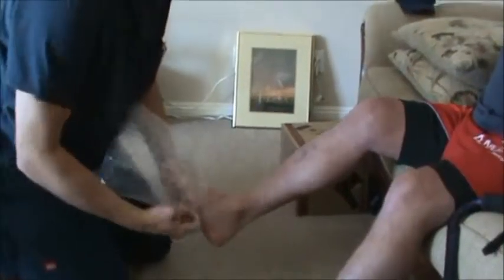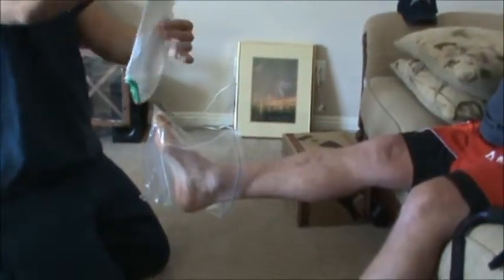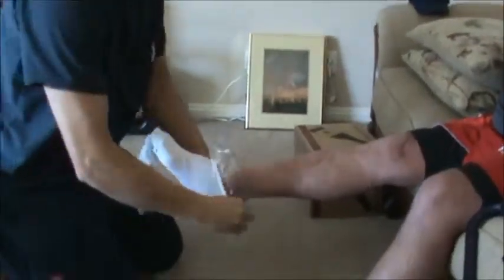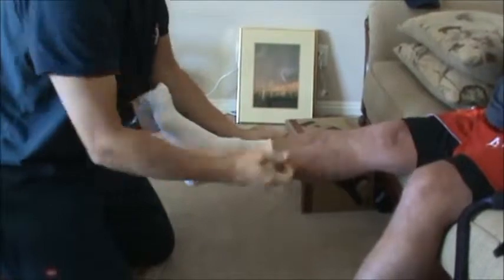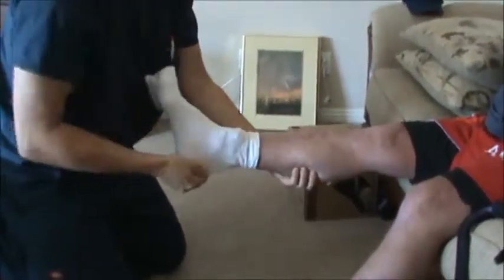Put your gallon plastic bag on here, try and get the heel as good as you can. Find the heel side on the stocking, just hold the stocking by the top, go over the toes, and slide it over the heel.